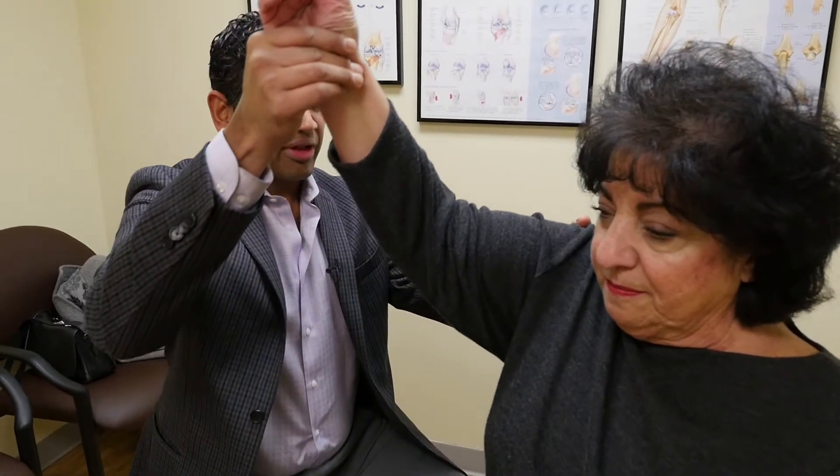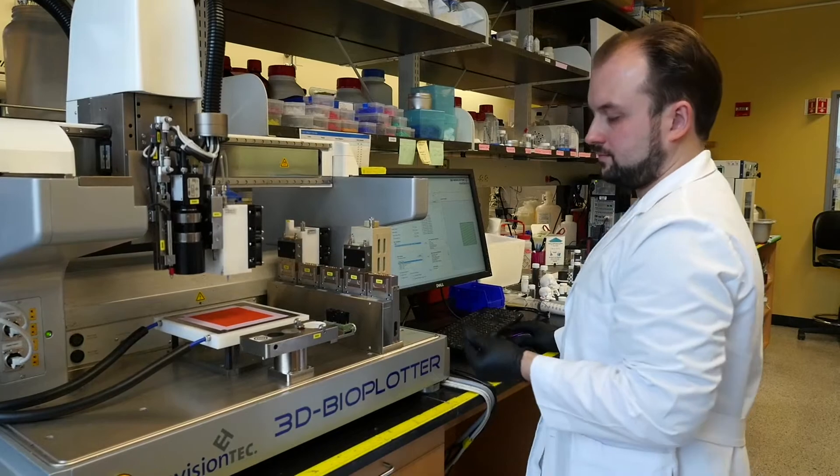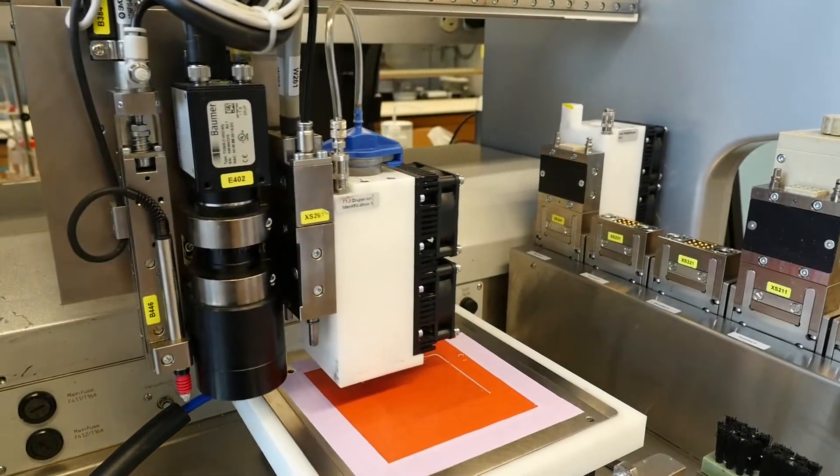Dr. Shah says surgeons are ready to embrace this new synthetic bone. It's less expensive than what's been available until now, and it handles better in the operating room.